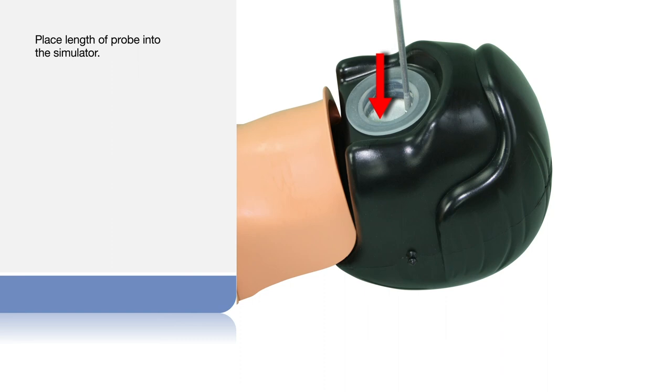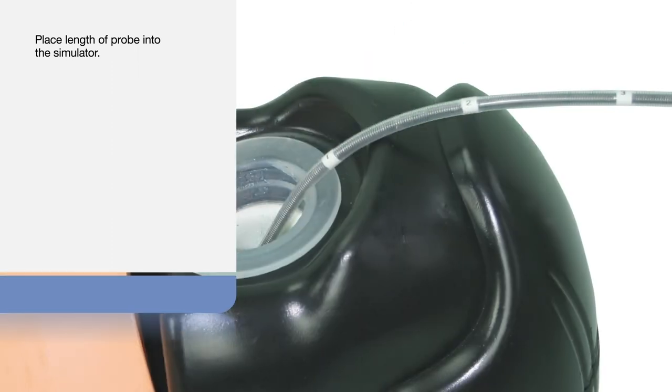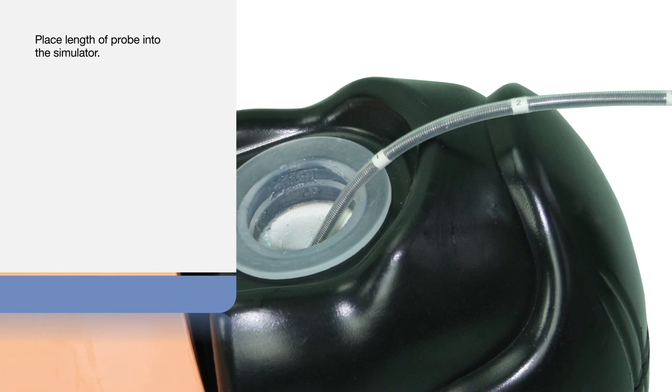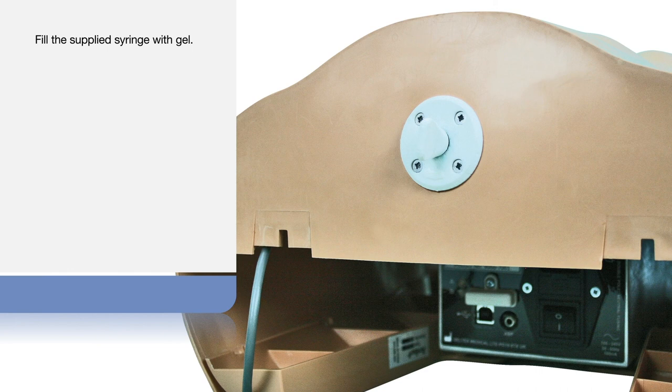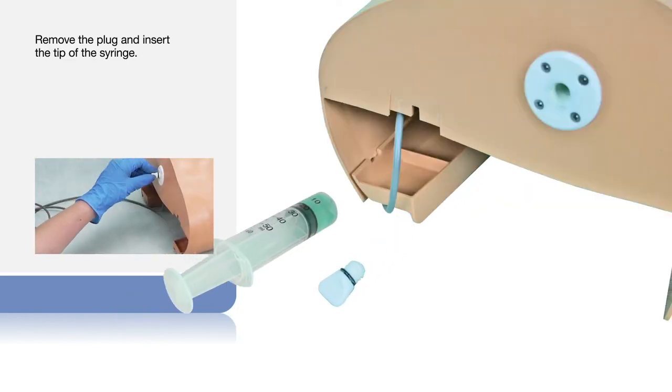Gently thread a probe into the simulator's esophageal opening until the end of the spring is just protruding. Then fill the supplied syringe with gel. The fill hole is located at the opposite end of the EDS. Remove the plug and insert the tip of the syringe.